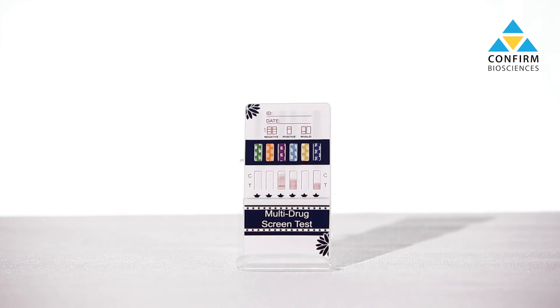Specialty dip cards test for K2 Spice, ETG alcohol, fentanyl, and other synthetic drugs.